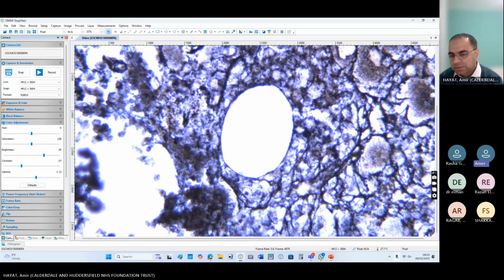This patient has megakaryocyte atypia as well. You have noticed small megakaryocytes in this one because they were contracted by the nearby fibers. And you have to exclude BCR-ABL1 according to the WHO 2022 criteria. And then you should have minor criteria as well: high LDH, leukoerythroblastic picture, splenomegaly, high white cell count. Then it will make a diagnosis of myelofibrosis.